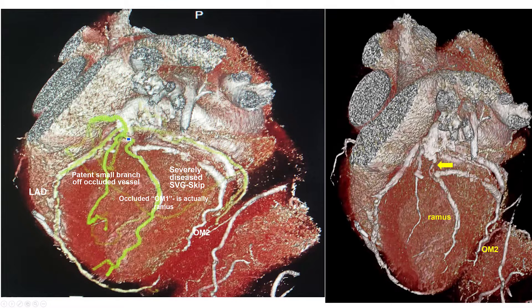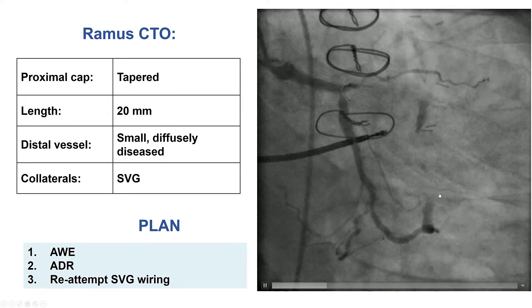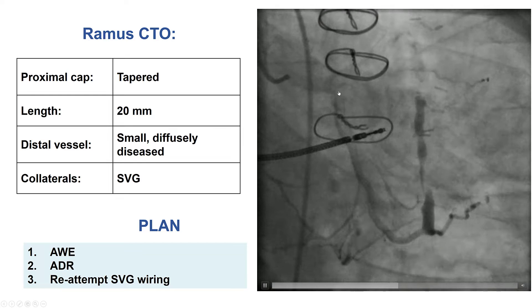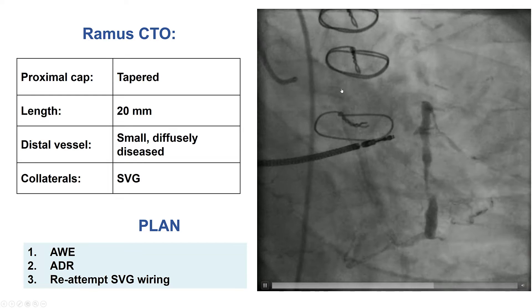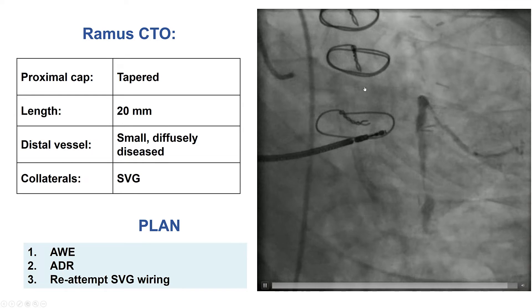Blood flows essentially from the left main down the circumflex, up the saphenous vein graft, and into the RAMUS. Therefore, our plan has changed, and the plan is to attempt the RAMUS CTO.